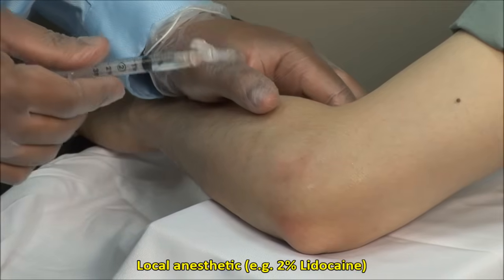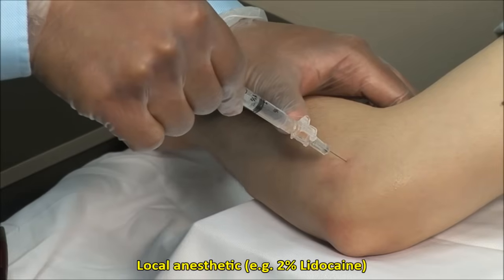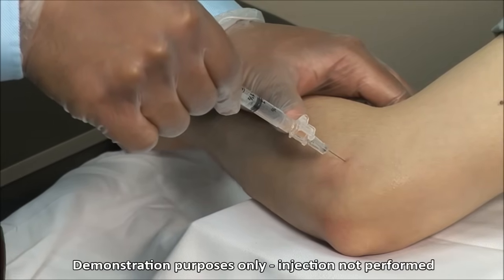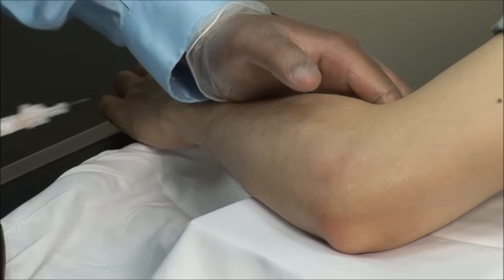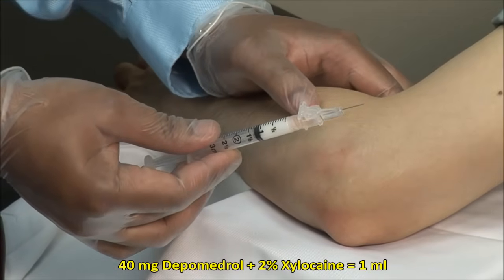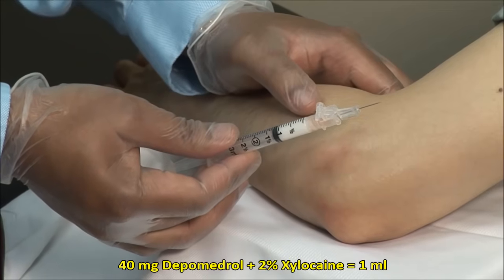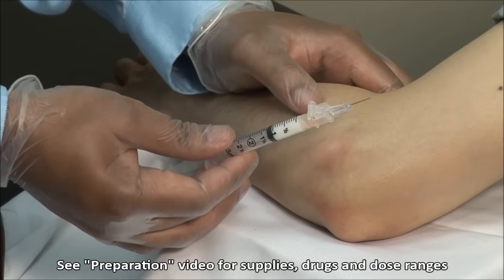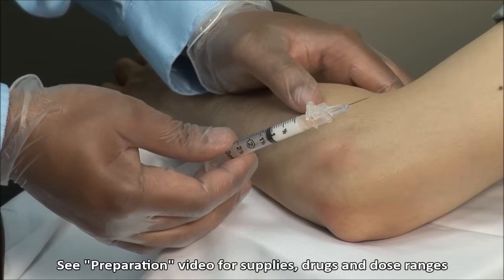Local anesthetic can be applied initially, or a mixture of steroid and local anesthetic can be applied at once. Here I have a mixture of 40 mg of depomedrol mixed with 2% xylocaine, and I am using a 25 gauge 5/8 inch needle. I used 0.5 ml of 80 mg per ml depomedrol and 0.5 ml of 2% xylocaine for a total volume of 1 ml.